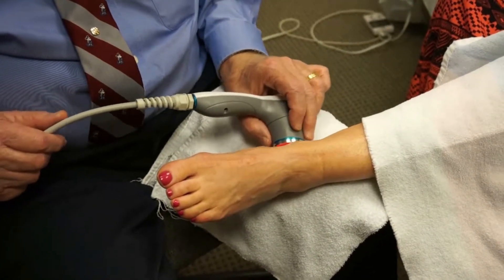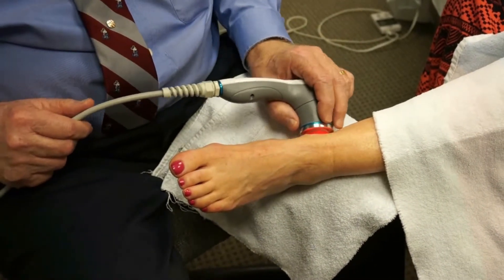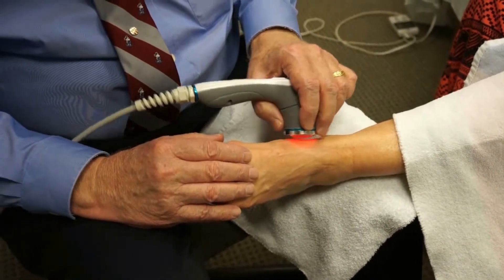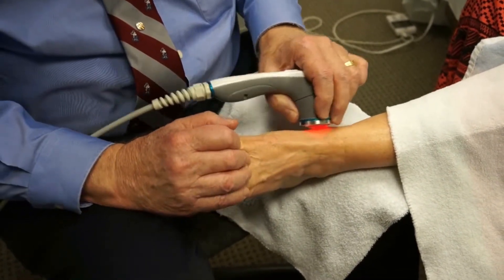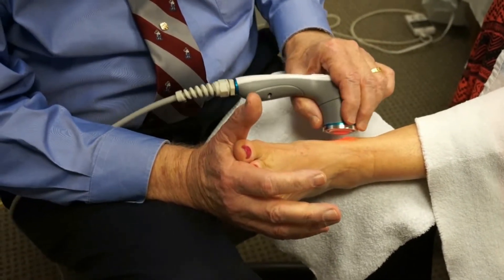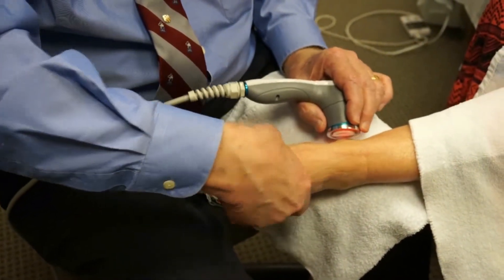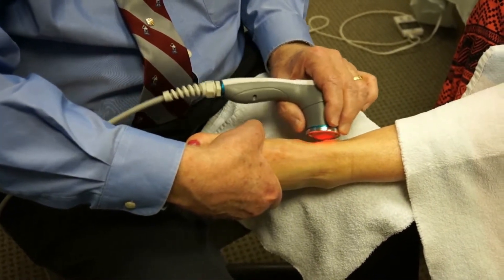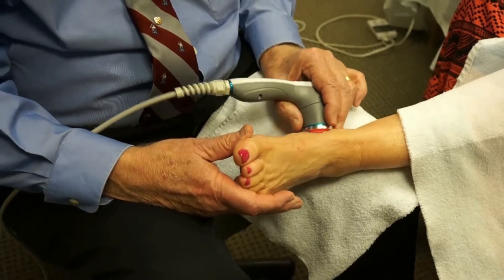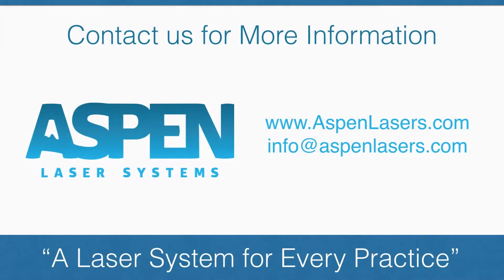How does that feel? Fine. Is it a little warm? Just a little bit. So while I'm doing it — pull up on your foot, push down — feel any pain? No. Let's turn the foot in. Now the other way. Any pain doing that? No. Very often, by the time you're doing all that and doing your therapy, the pain is totally gone.